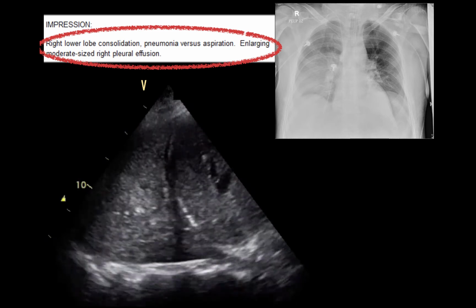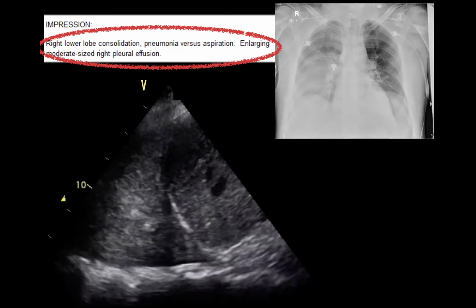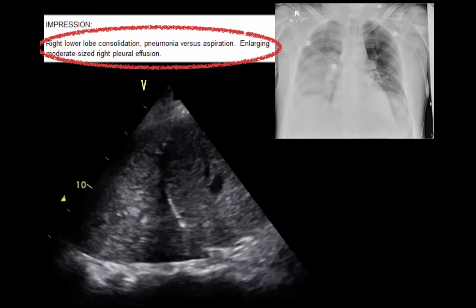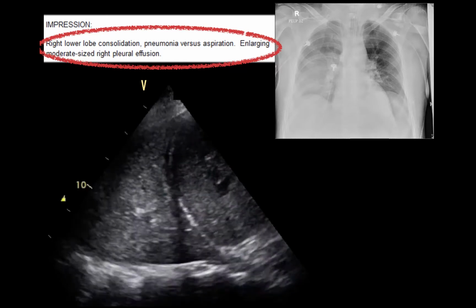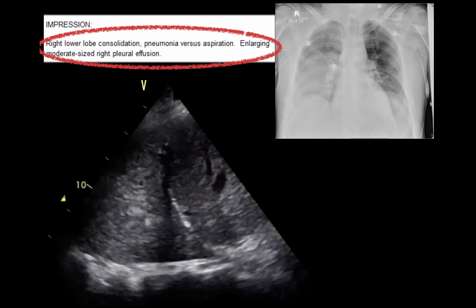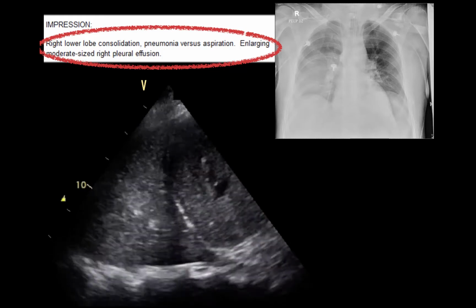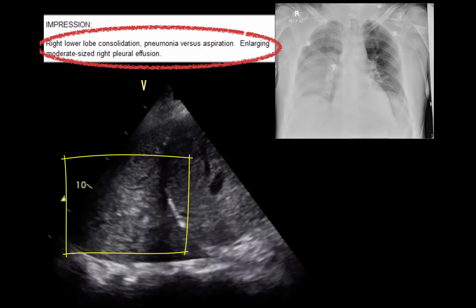This is another good example of a chest x-ray in which there is a diagnostic dilemma. The classic read of such an x-ray would be pneumonia versus right pleural effusion. The ultrasound is quite clear. There is no pleural effusion, as evidenced by the absence of any echolucent space above the diaphragm. There is presence, however, of a large consolidation that occupies most of the lung.